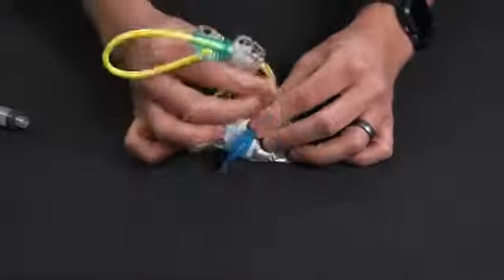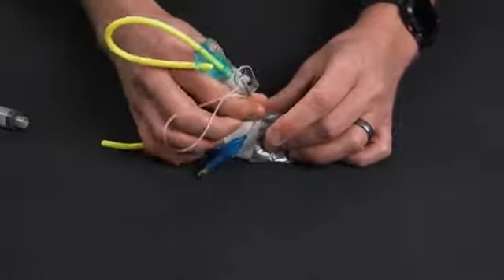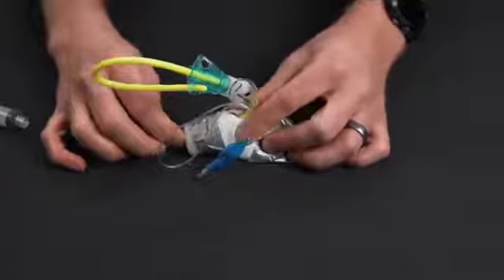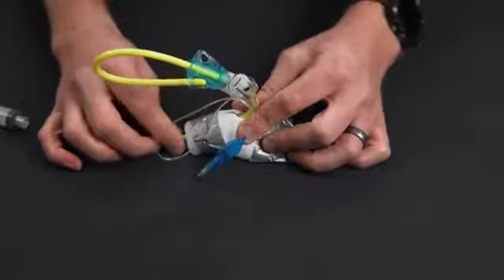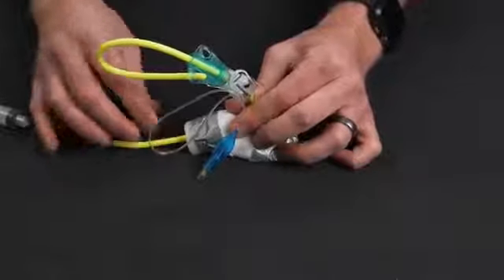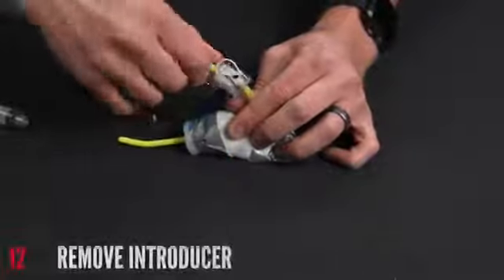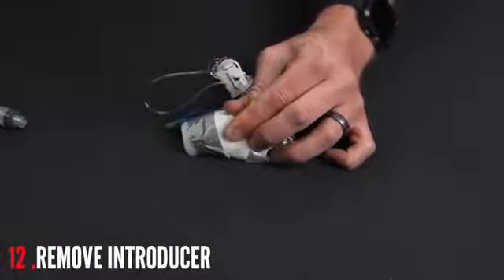When you get to this opening itself, you're going to have to twist it a little bit because it might get hung up. And we only want to insert the tube just until the balloon is no longer visible. Once we're in this position, we're going to hang onto that tube. We do not want to let that tube go at all because we don't want to lose the airway. And we're going to remove the bougie.